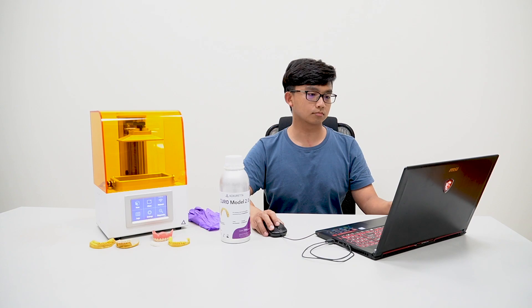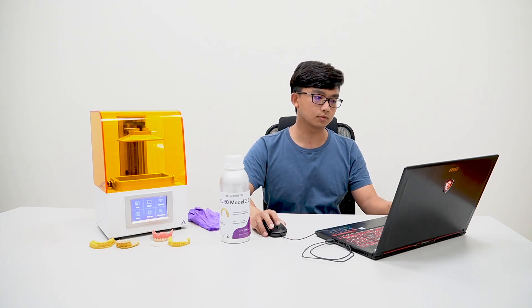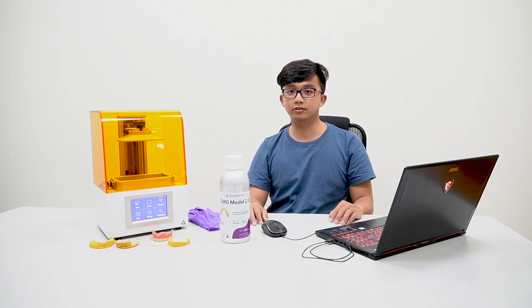Today we're going to learn how to print dental models with our field application engineer, Hank. We'll be printing remotely today.